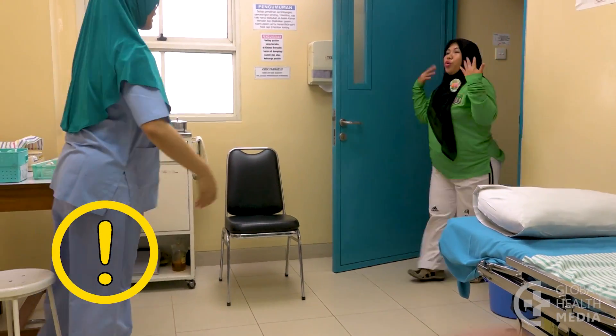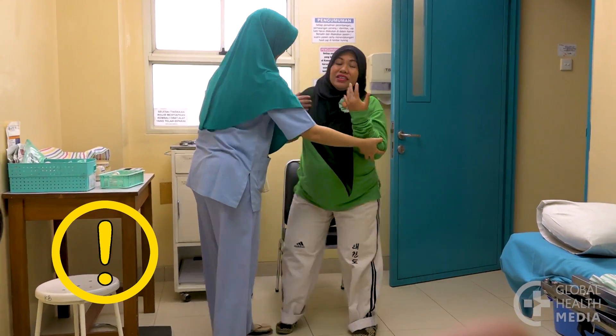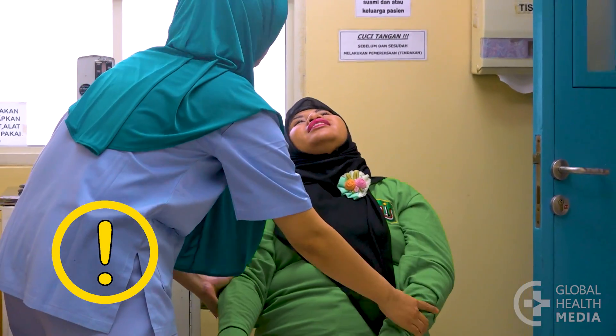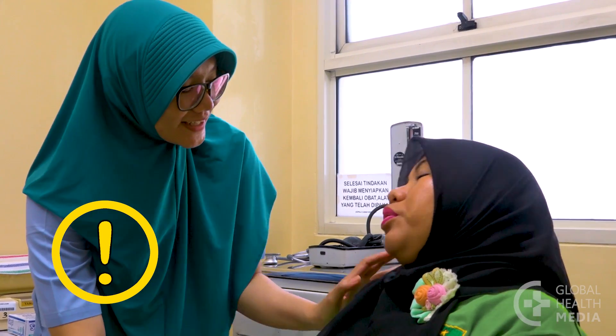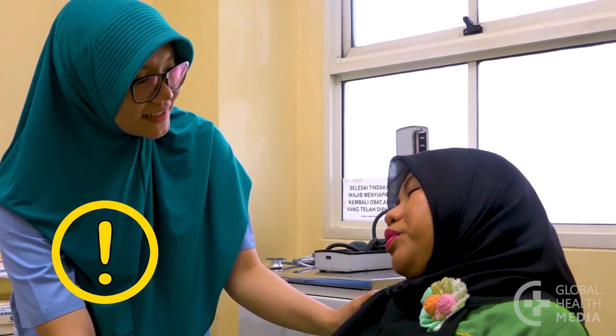Be sure the person is relaxed and comfortable. If she has hurried to her appointment, arrives stressed, or has just smoked or had coffee, have her wait at least five minutes before taking her blood pressure.